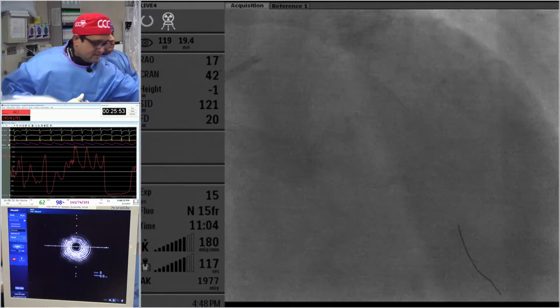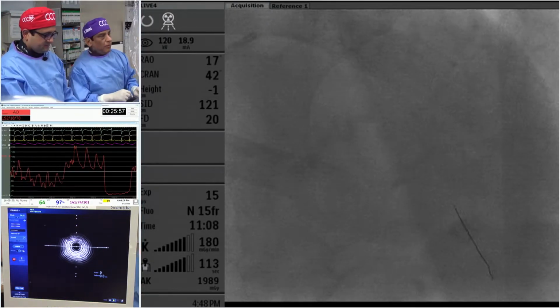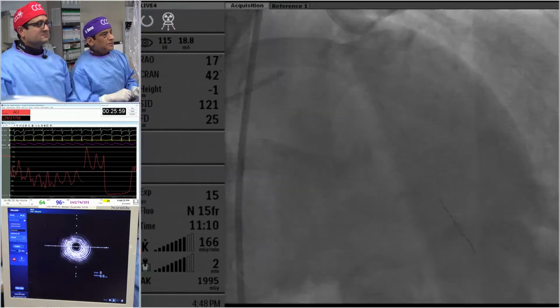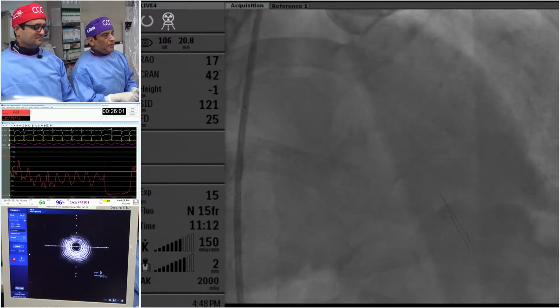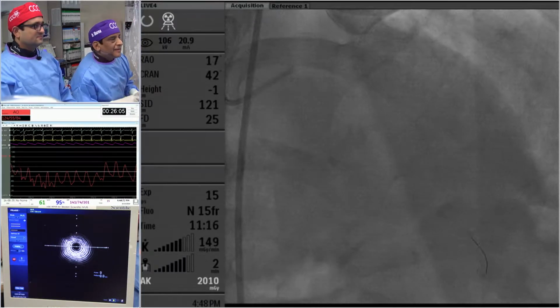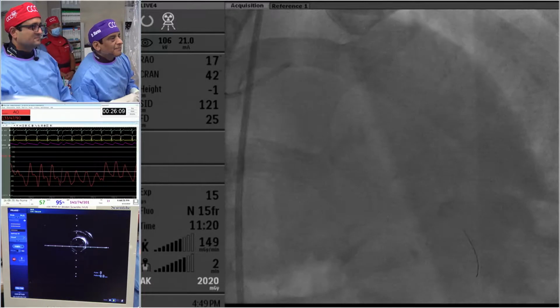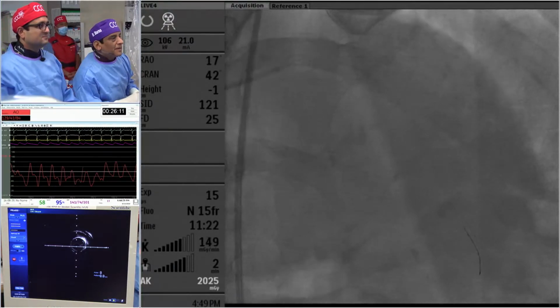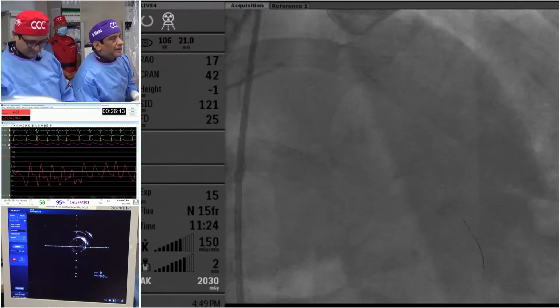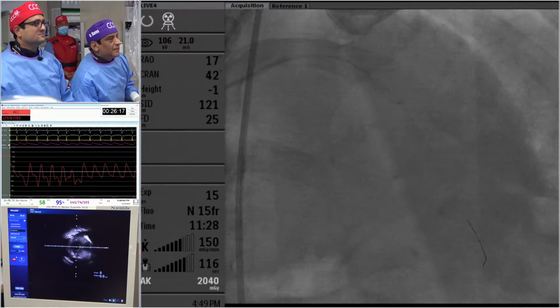Okay, the low mag, last year's angiogram. Low mag. So first we do just the short one, low mag again. So do the proximal segment, the left main again, because I may not have any time to show you the entire vessel, because it will take quite a bit unless we have a 2 millimeter per second withdrawal, but it's 1. Okay, let's start from here. So that the Ran wanted to know what that is, we will show.